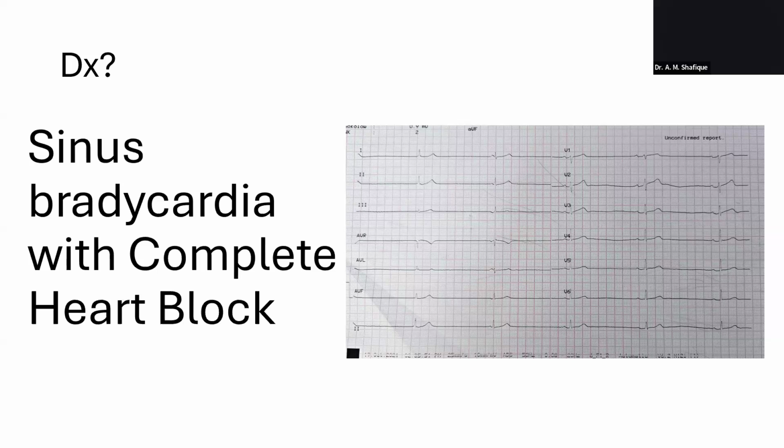No, sir, I just want to differ with you because sinus bradycardia means the sinus rate is low, but there is a complete heart block. That is why there is no relation between P and R.